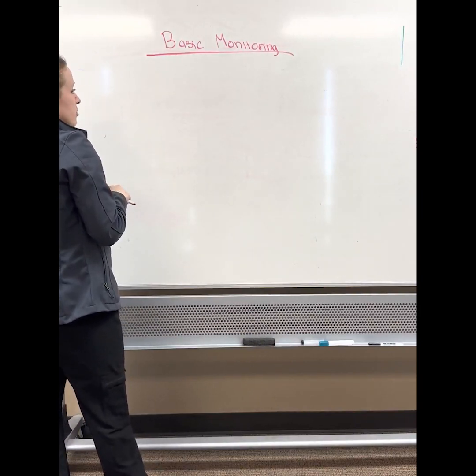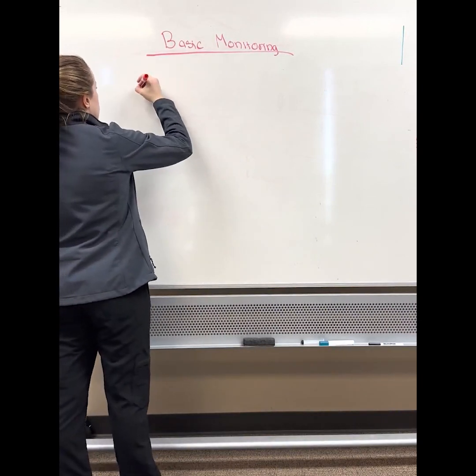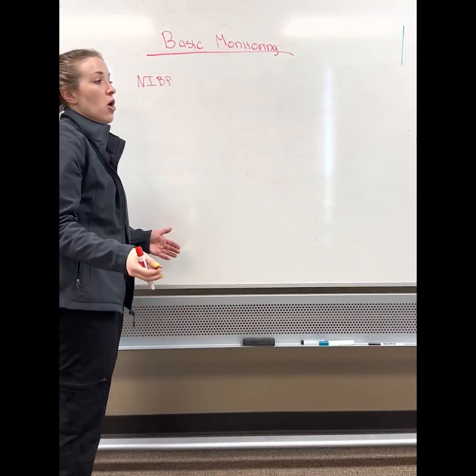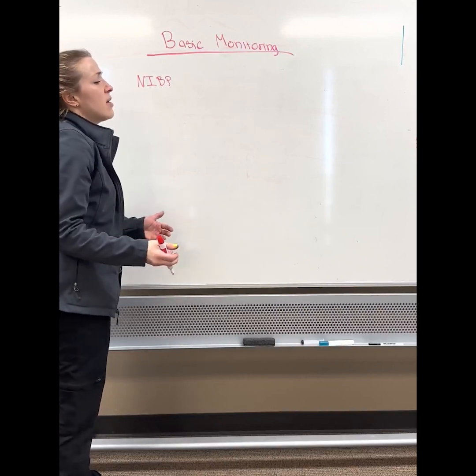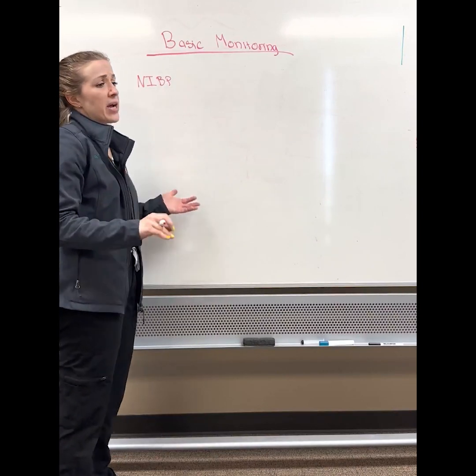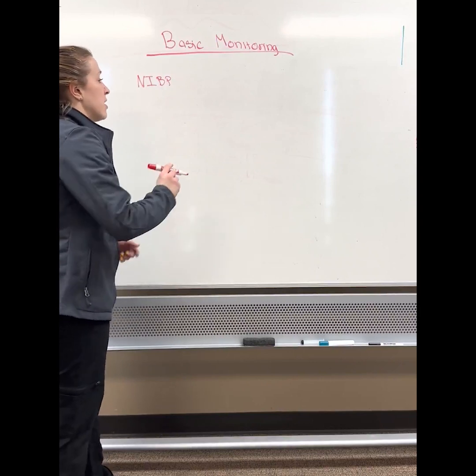Okay, last two things I want to talk about are going to be blood pressure through a couple different means, and then temperature, which is pretty straightforward. So the first thing I want to talk about is non-invasive blood pressure, NIBP. So blood pressure just tells you about the average flow in the arterial tree. And blood pressure is really important because this tells us about the mean perfusion that is happening in the animal. So there are all types of consequences that are associated with very high or very low blood pressure. So maintaining an adequate blood pressure is really important, and it's one of the fundamentals of practice.